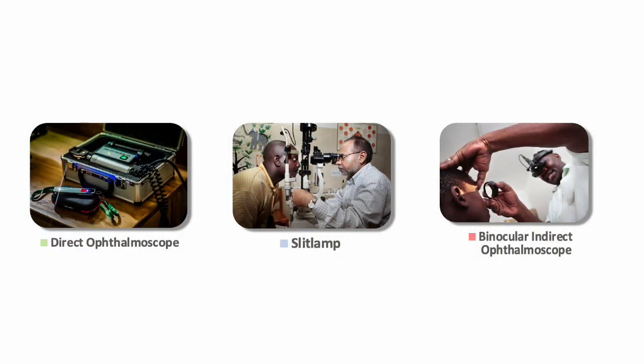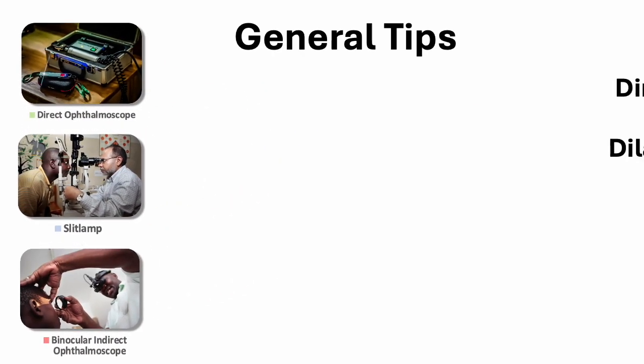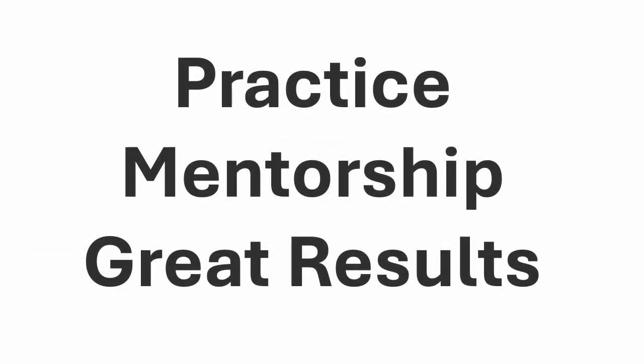At first, when using any of these techniques, it can be difficult to see the macula clearly. You may feel a bit dispirited, but with practice and mentorship, great results can be achieved.